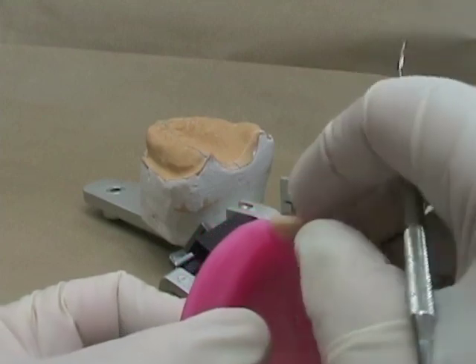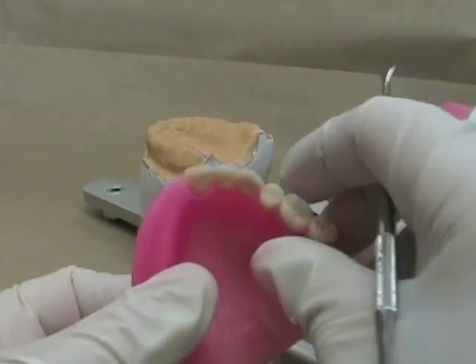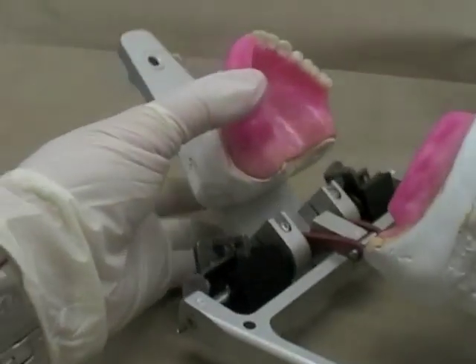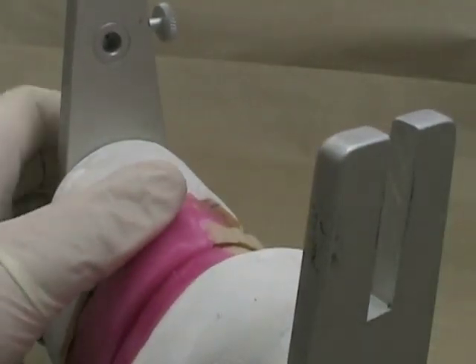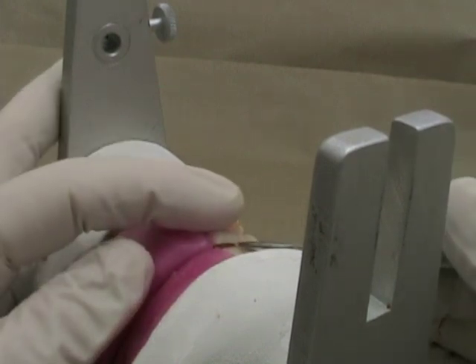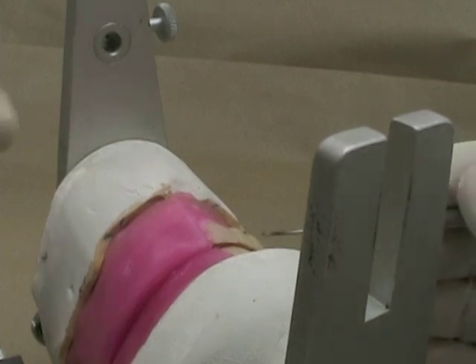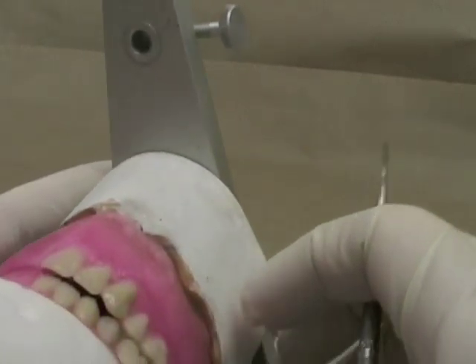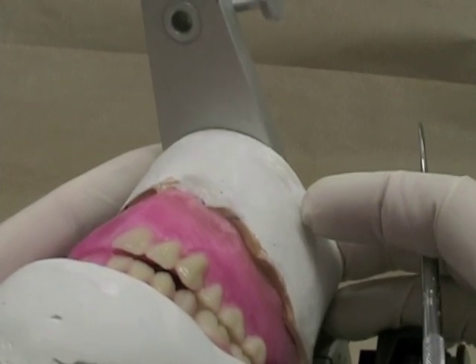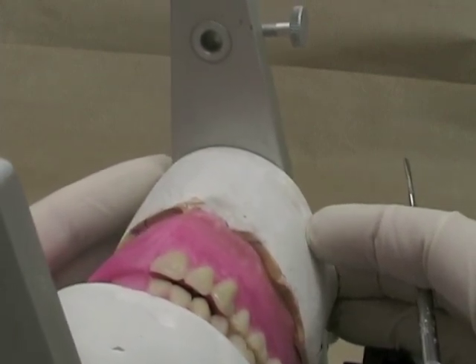Now I'm going to use a little pressure and move the tooth out a little bit, put it back on my rim, and check it against the rest of the teeth. I'm looking to make sure that my overjet is even between my central incisors and my lateral incisors, and that's looking a little bit more even now. We'll proceed then to start setting the maxillary anterior teeth on the opposite side.